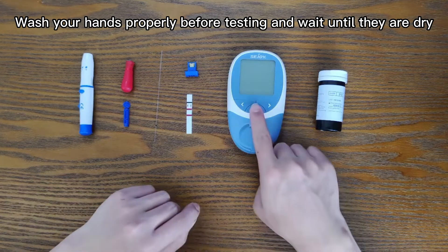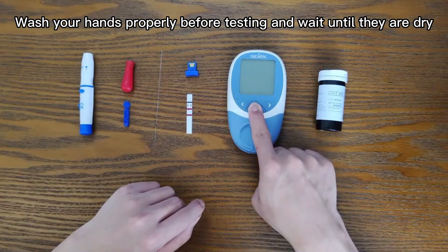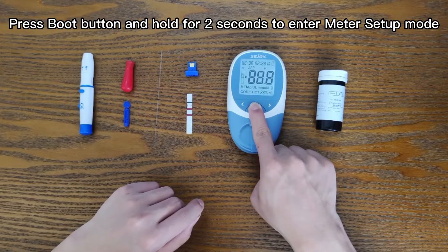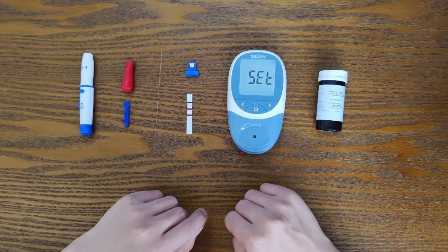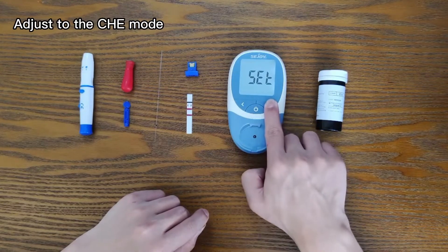Wash your hands properly before testing and wait until they are dry. Press the boot button and hold for 2 seconds to enter meter setup mode. Adjust to the CHE mode.